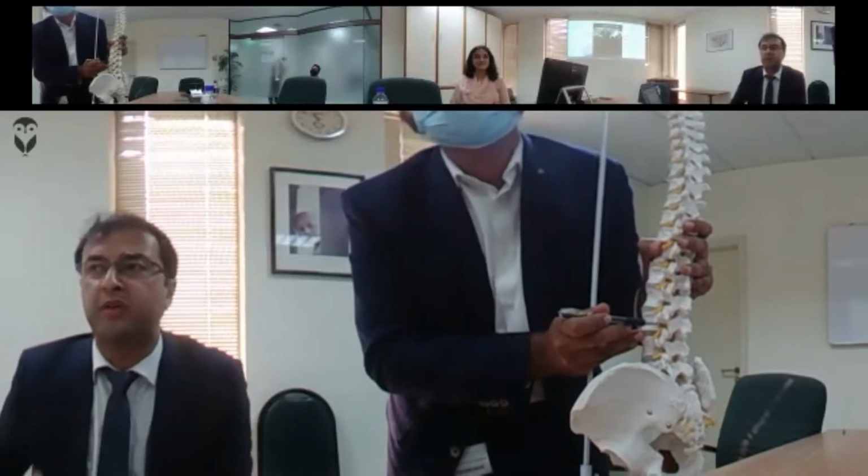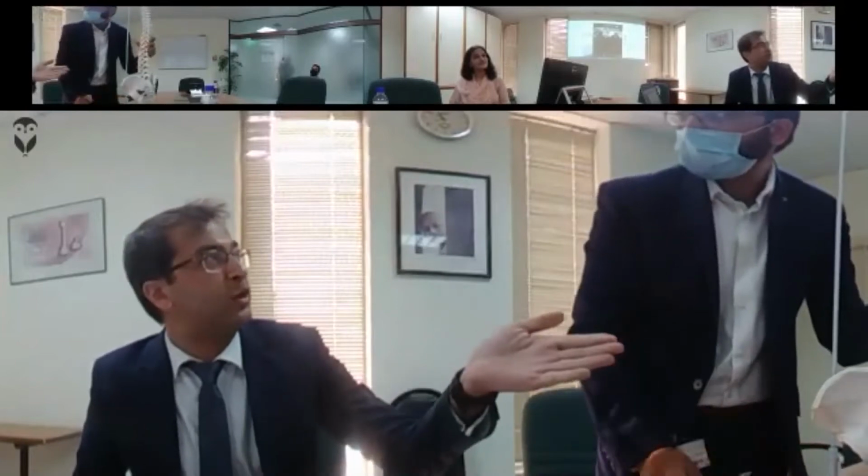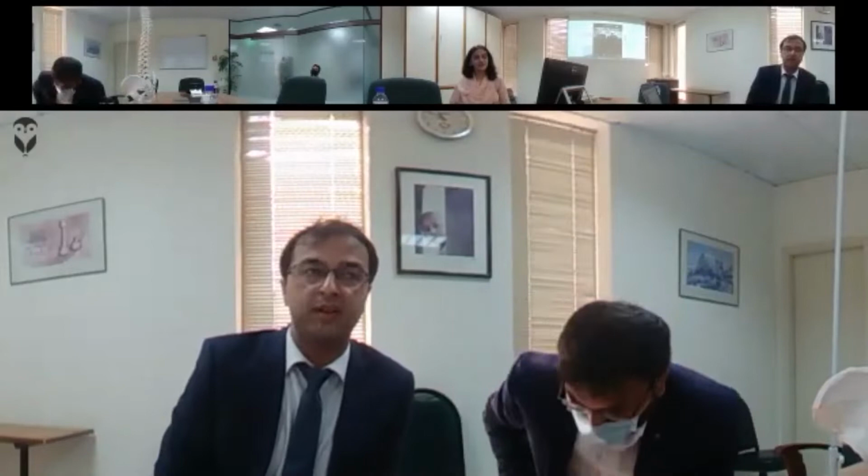Yeah, the key is just to make sure that you keep on aspirating there. And another key tip is not to go beyond the 6 o'clock position. Absolutely. Far too medial, to avoid intrathecal injections. So these are quite vital.